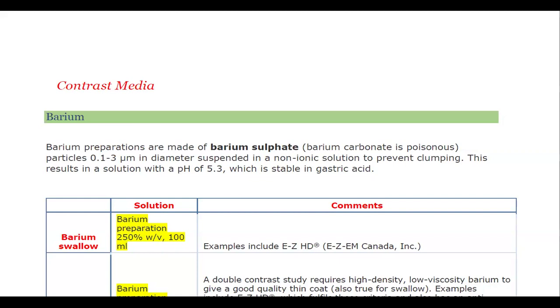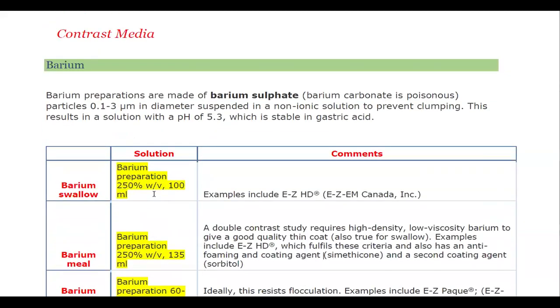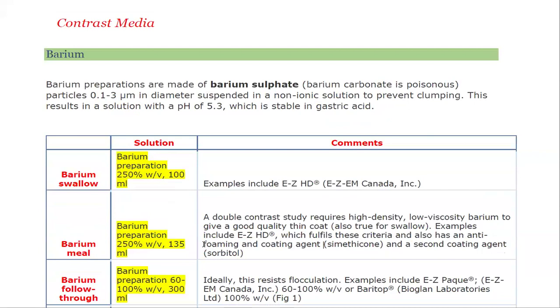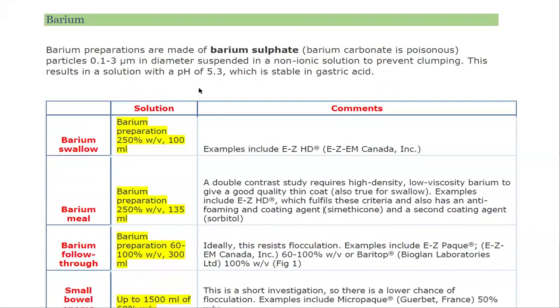It is relevant even in routine work, if you are dealing with fluoroscopy or contrast media, even with CT scan. So I will start by showing you some information regarding the contrast media itself. Barium sulfate is one of the most commonly used in GIT examination.